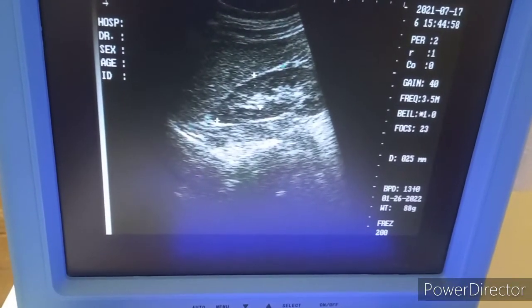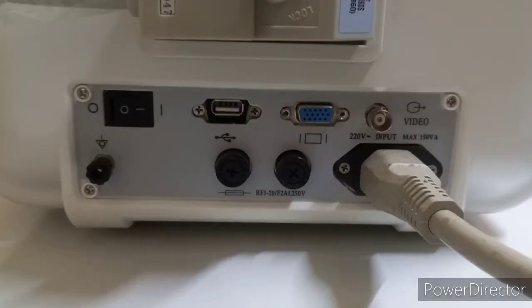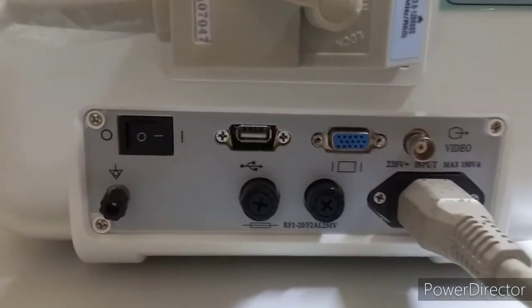The device features a 12-inch LCD with high-definition resolution, a USB port, video out, and VGA out for connecting to an external LCD display.